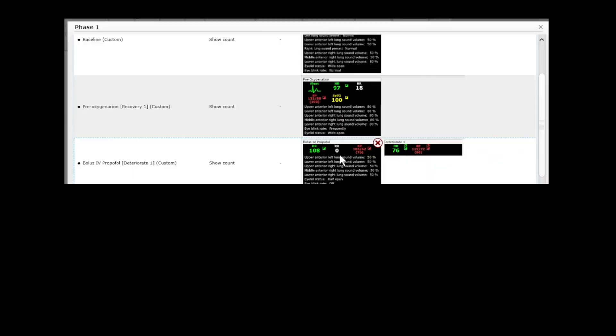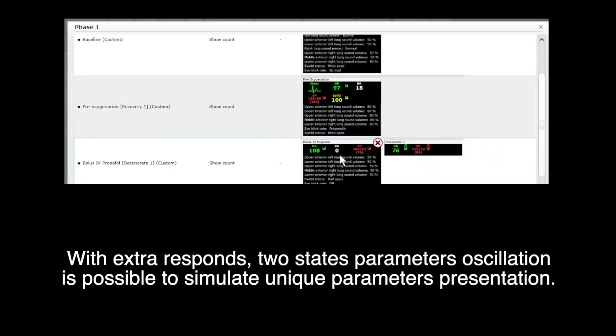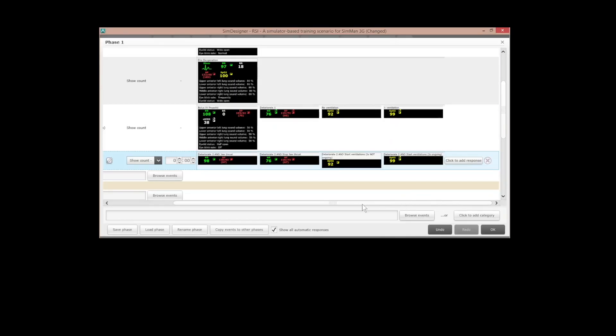With extra response, two-state parameters oscillation is possible to simulate unique parameters presentations.